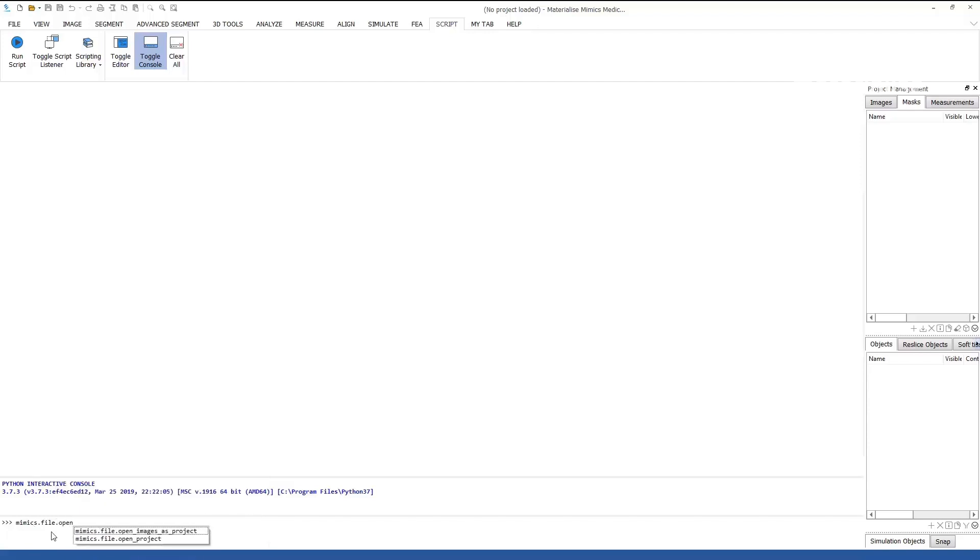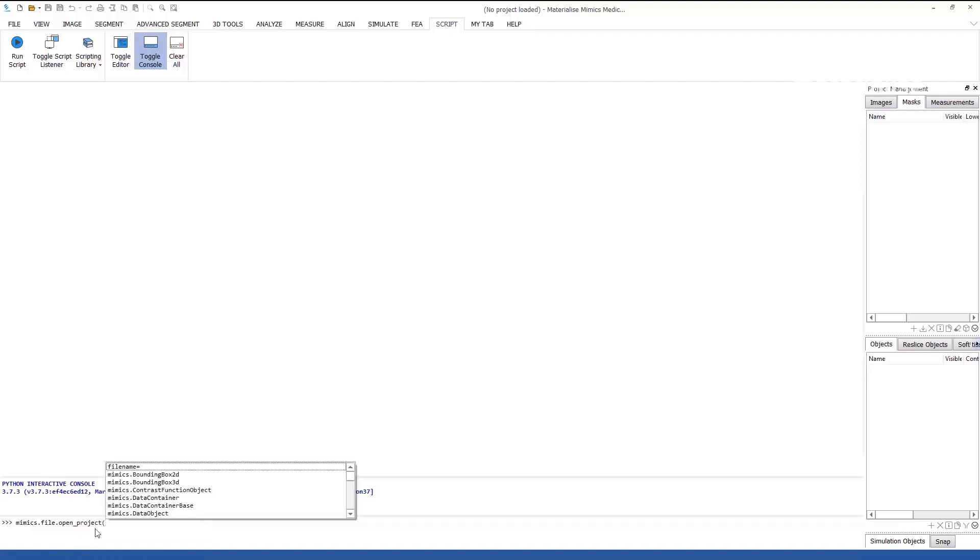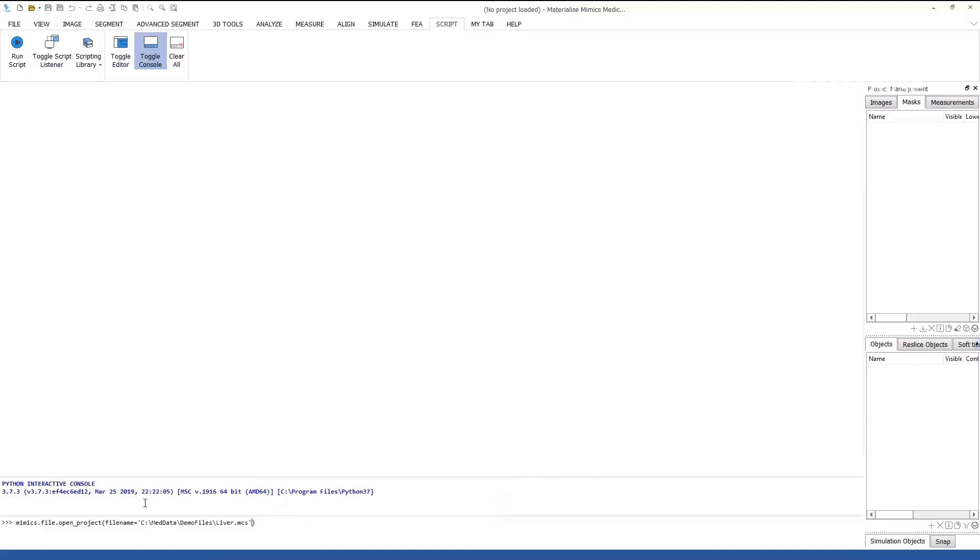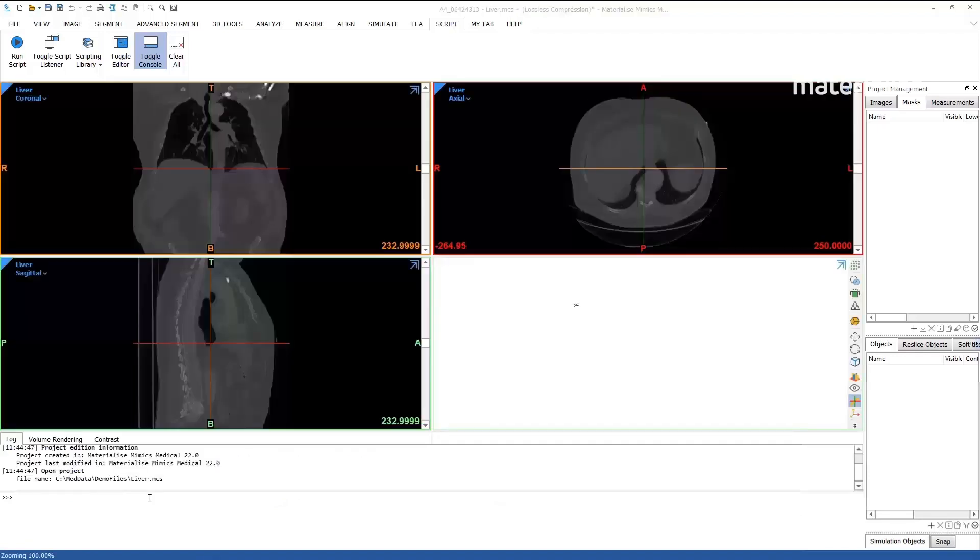Scripting in the console has become very easy with the built-in autocomplete function. You are now ready to start writing your scripts and automating your workflows in Mimics.